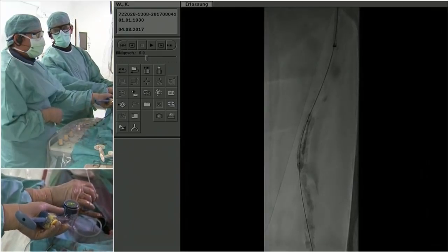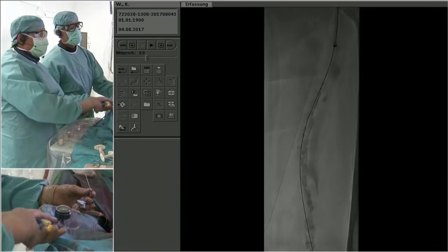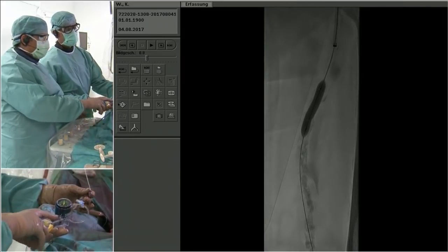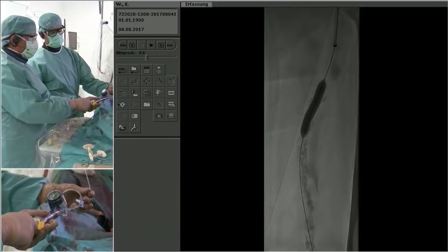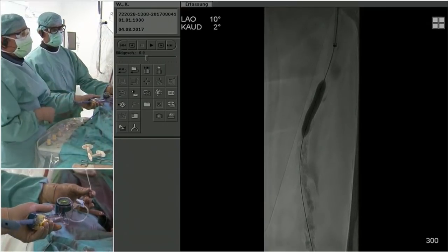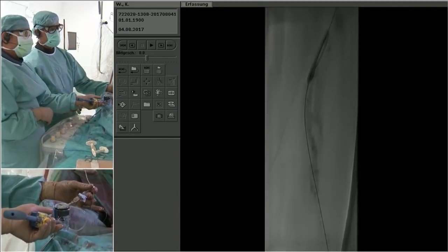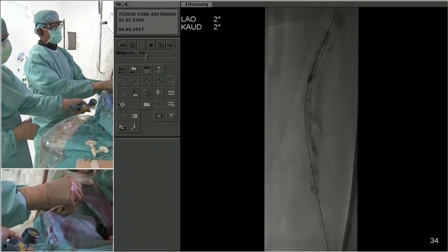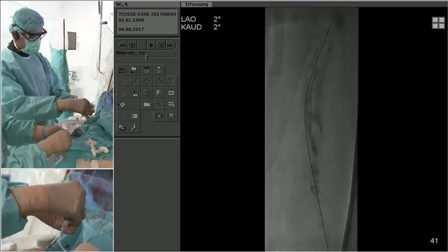Hey, Andrej, can I ask you a question? Given that you may not do that crack and pave technique, can you give us some information regarding your sizing of the Viabond relative to the Supera, given that Supera comes in half sizes and the Viabond doesn't? How do you size the two? Yeah, good question. It's easier for us in Europe because we still do not have the half sizes, unfortunately.